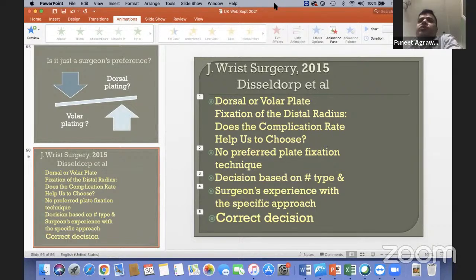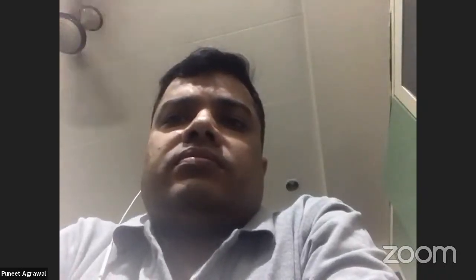Sir, what is your usual time to remove the dorsal plate? People generally would advocate removing it after about a year or so, once the fracture has healed very well. That is the time, and it is recommended only because the plate may cause irritation of the tendons and problems with tendon ruptures and so on.